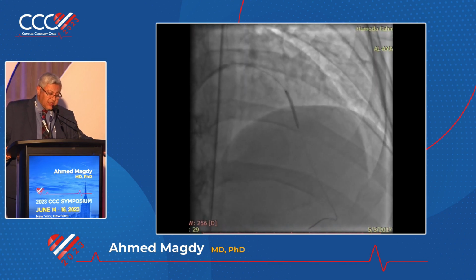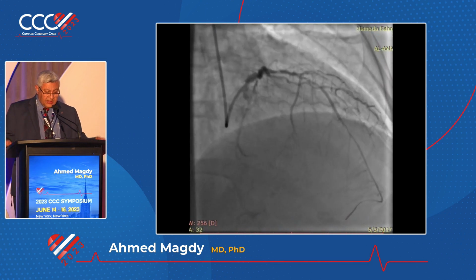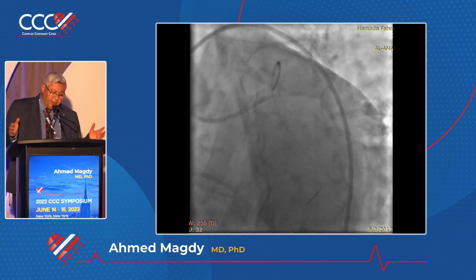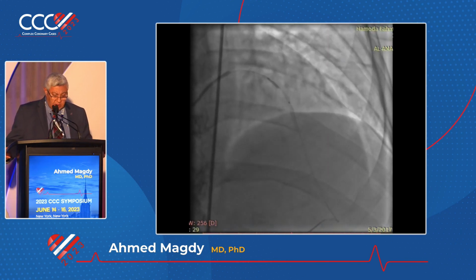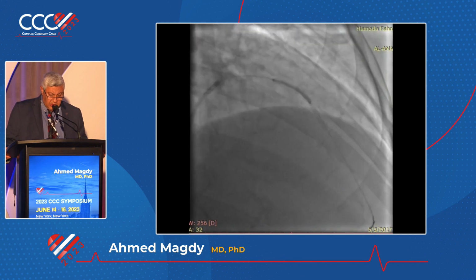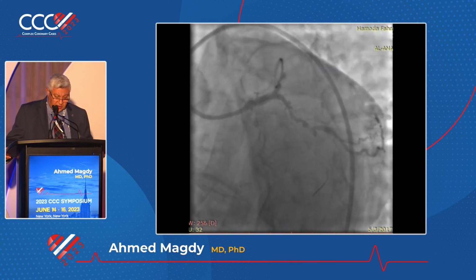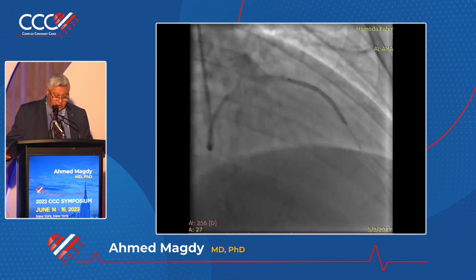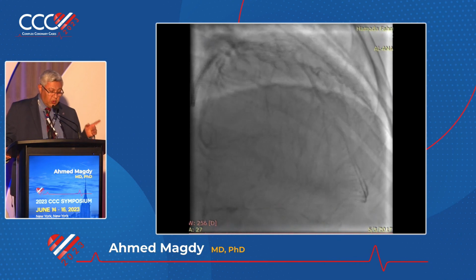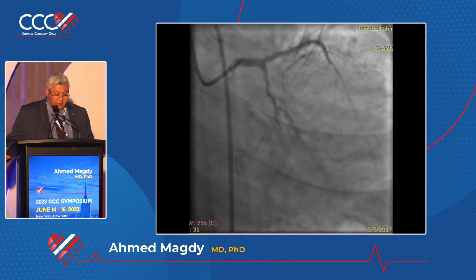And the other thing is the landing zone. If you are stenting these arteries, you need to know where to stop. FFR may help you, but not very much. And IVUS is important. So, stenting distal to proximal. And then you need to address, when you come to the left main, what we'll do with the CX first. Maybe you can stent the CX before addressing the left main.